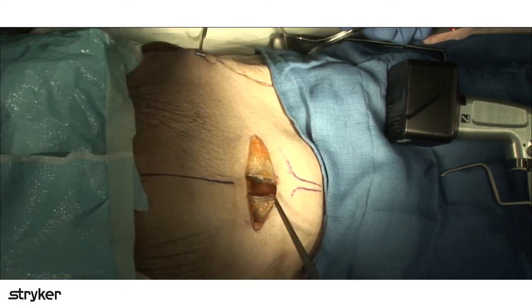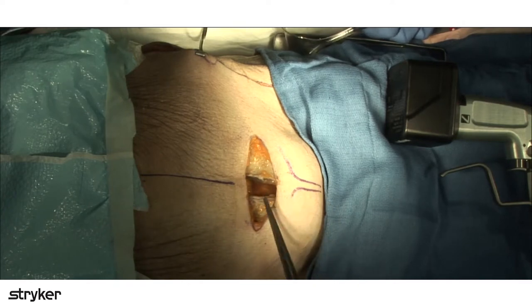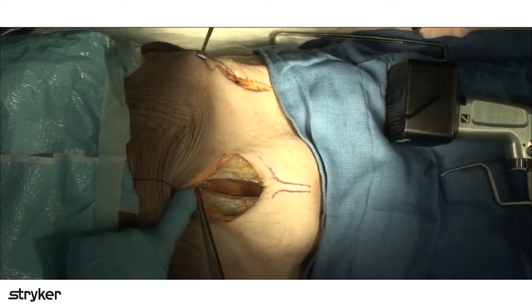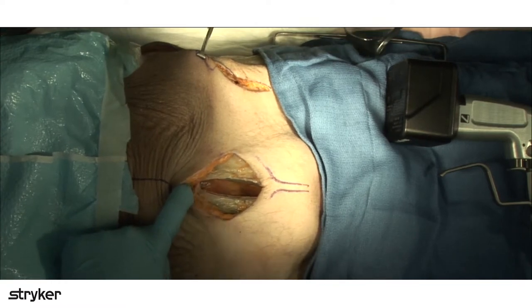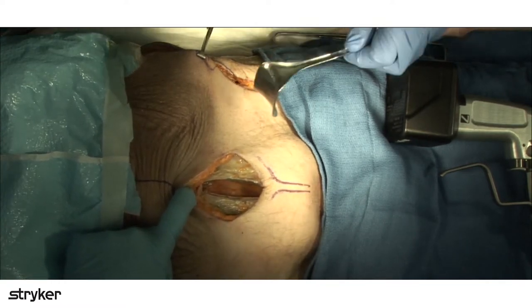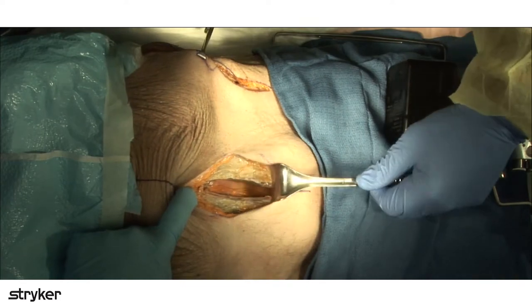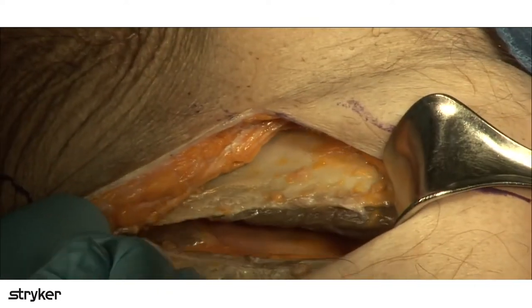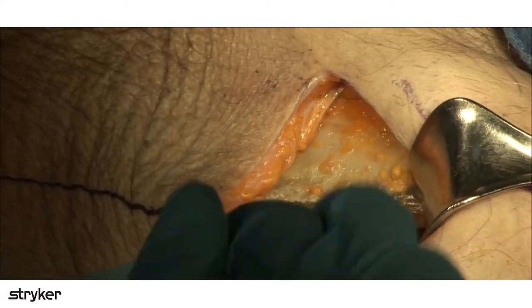And the way that you accomplish that is you have to do three things, really. One is you have to split the rectus up fairly proximal. So getting the rectus out of the way is coming up very proximal, but also very distal.